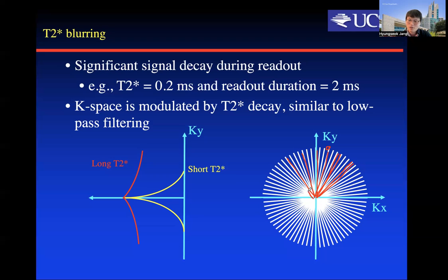So when you sample this single line, with the associated echo time, the signal of short T2 tissue decays like this, for example in the ky direction. Then when you get to your desired k-space location, which corresponds to your desired spatial resolution, there's no more signal remaining.